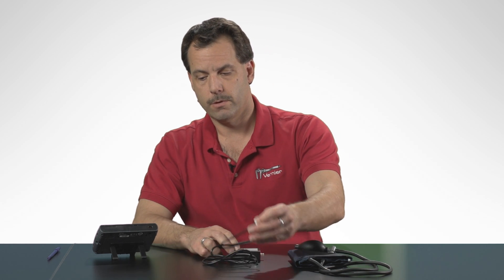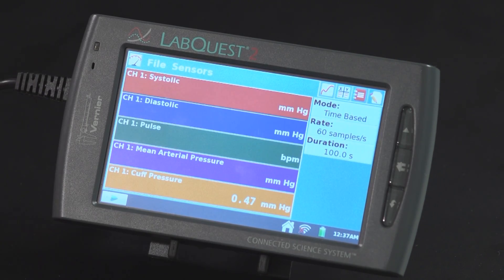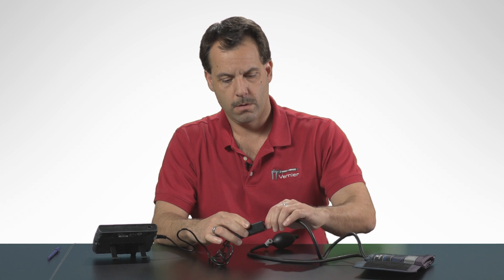What I'm going to do next is attach the cuff to the blood pressure sensor, plug the blood pressure sensor into the LabQuest, and then attach the cuff to my arm. So I'm going to plug in the blood pressure sensor, attach the cuff to the sensor itself, and then next I'm going to put the cuff on my arm.